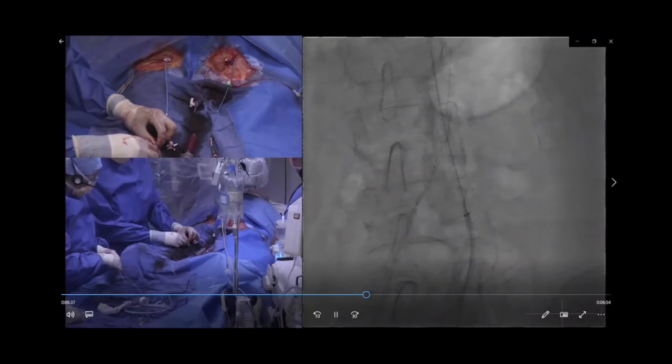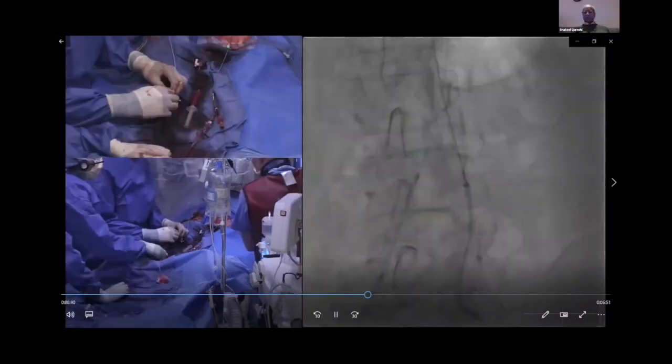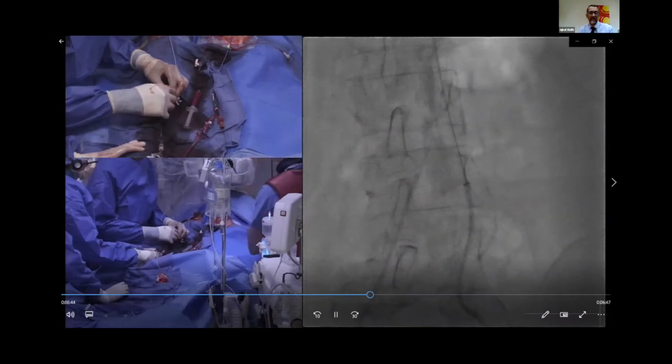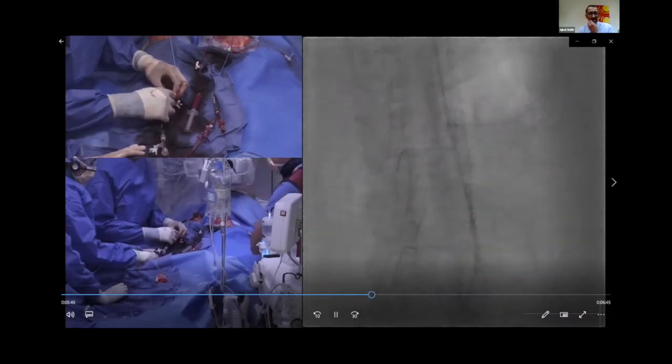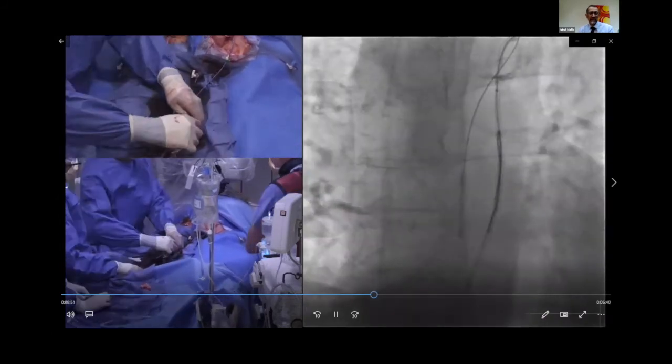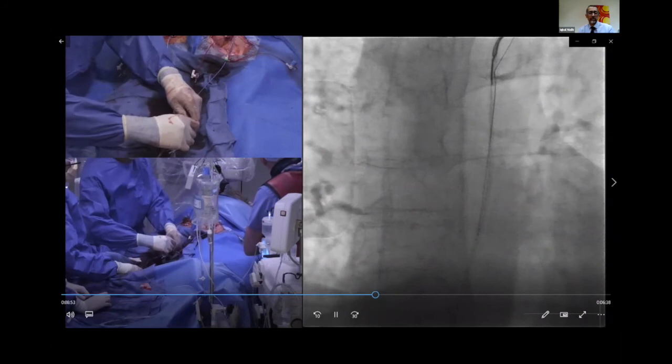Thank you very much. And presumably you've got no idea how much energy is actually being used, is that right? Well, we put it on 50, so it's pretty high anyway. Whenever I'm doing a transseptal, and I do a transseptal with the same if I've had difficulty rather than a specific radiofrequency needle, I'm using 30, but this is a very calcified aorta.